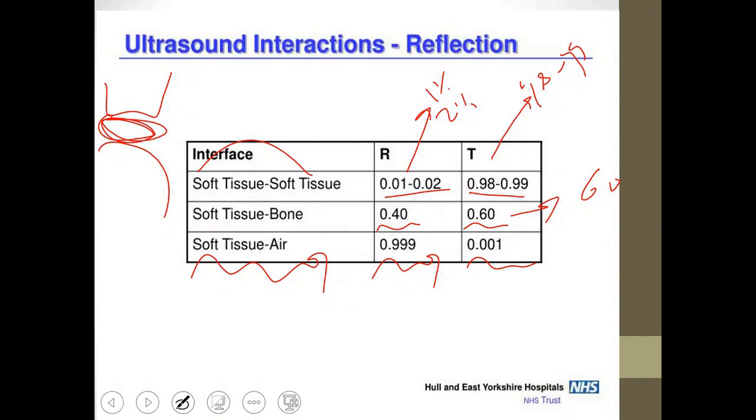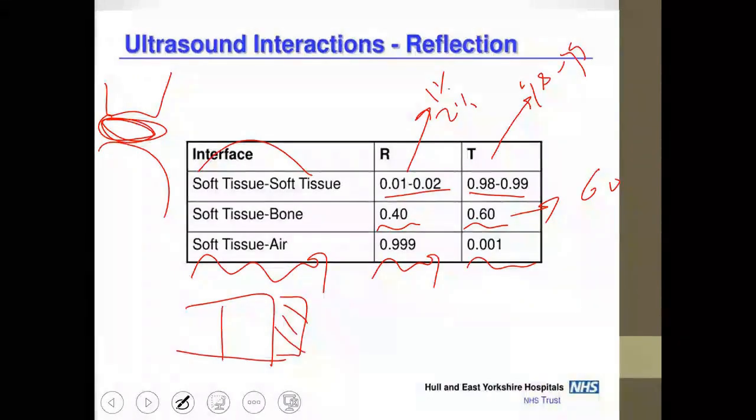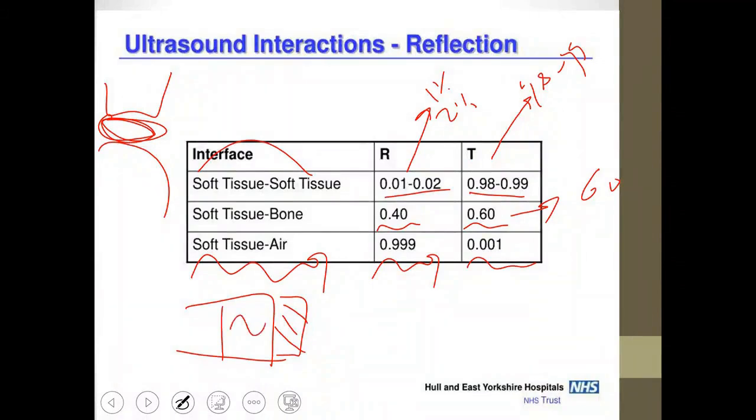The topic of impedance is crucial, especially when we talk about the backing block material that provides damping. We mentioned that the backing block material has the same impedance. Why the same impedance? Because if there is something reflected or something that returns from the crystal and goes in that direction, it does not experience reflection.